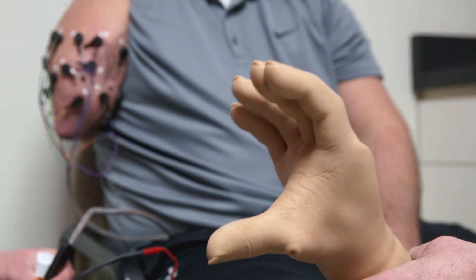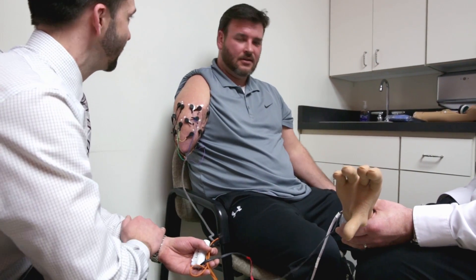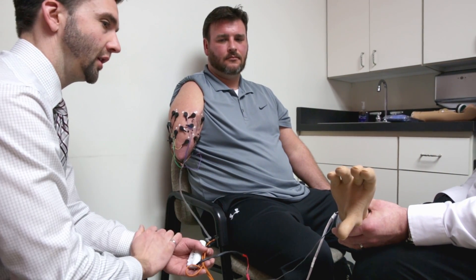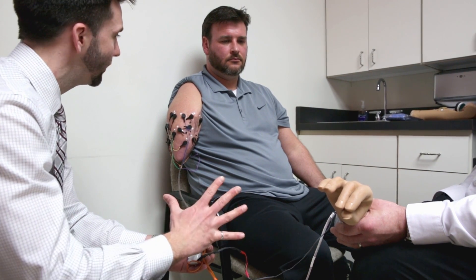Close. I'm just tensing it up — I can feel it just... That's okay. Try this for me. I know we didn't train the system doing it lighter, but I want you to try that. Close it just a little bit lighter, not squeezing too hard. There you go. And open a little bit lighter.